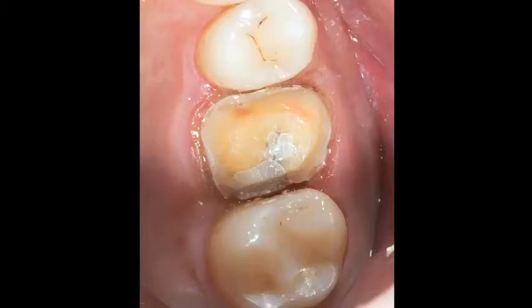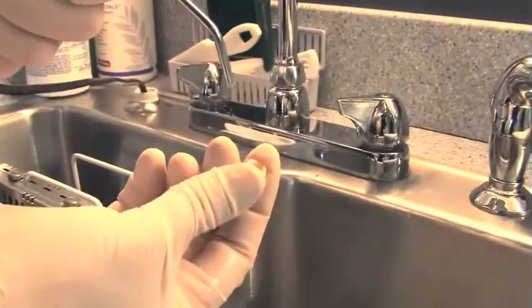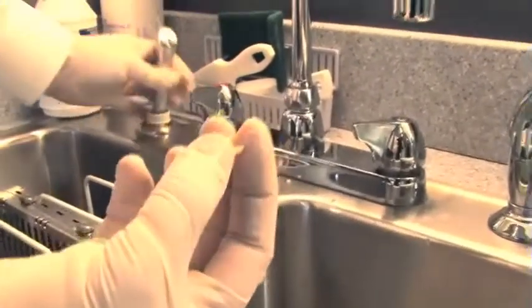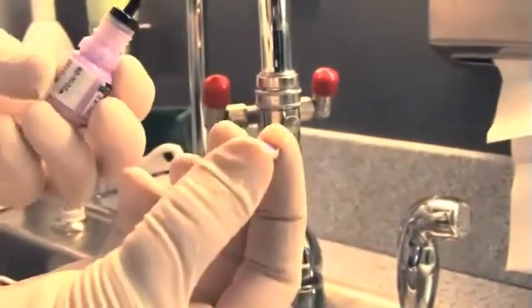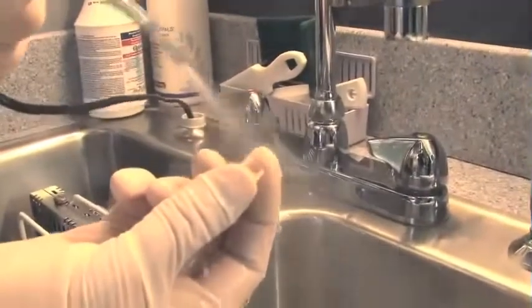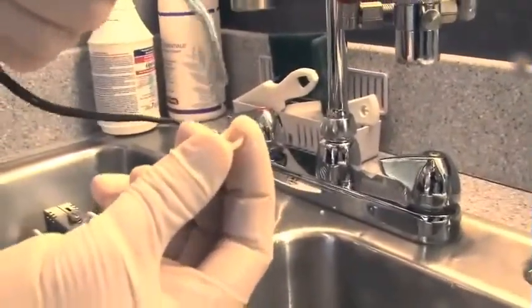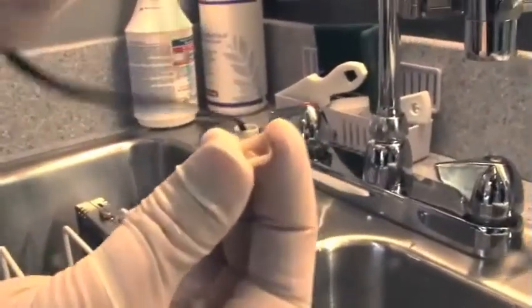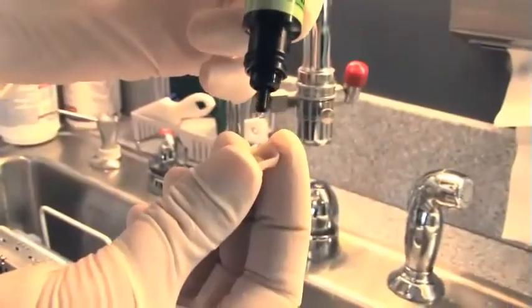You see a molar that we've prepared here, and this is going to receive a solid zirconia crown. I've tried that crown into the mouth, and because it came in contact with saliva, I'm decontaminating it at this point. So after rinsing it out, we're placing a liquid zirconia oxide inside of the solid zirconia oxide crown, and that's going to bond to any of the salivary phosphates that were bonded to the internal portion of that crown.